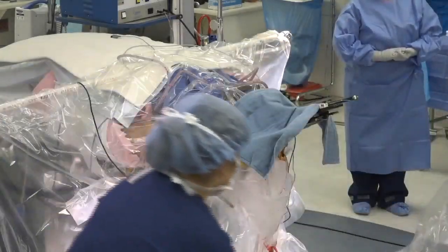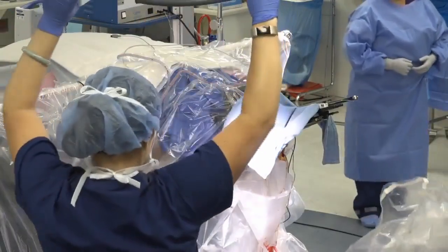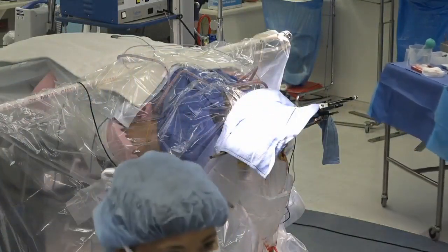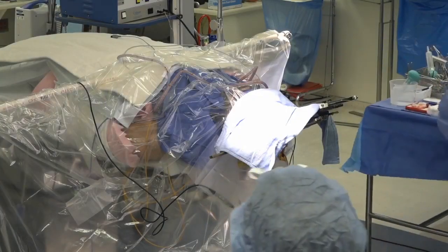So right after surgery, typically people go home the day after surgery. If they're in their mid-70s with Parkinson's, we might keep them for an extra night. Not much pain. The pacemaker that we implant a couple weeks later is really what delivers the therapy.